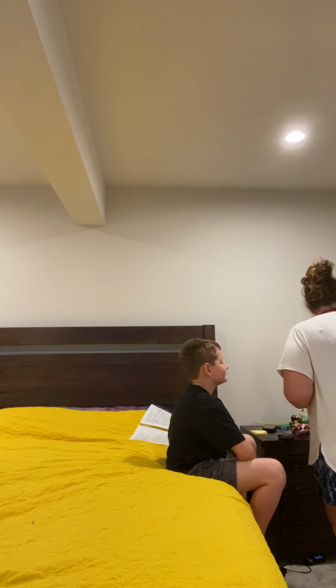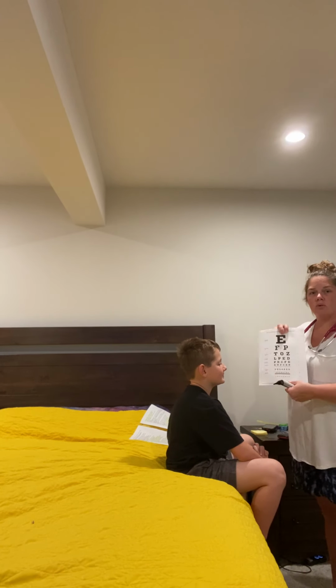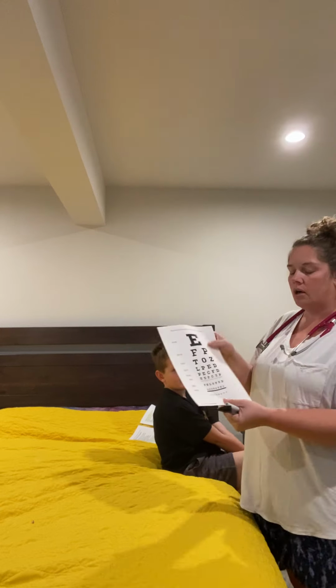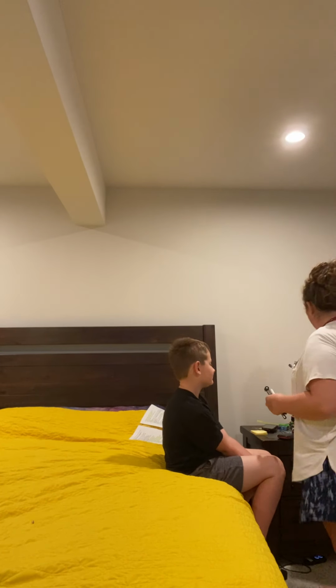Now, I also have the Snellen chart. He will do that standing at 20 feet away, and he will read the lowest line that he can read. So we will do that in a little bit.